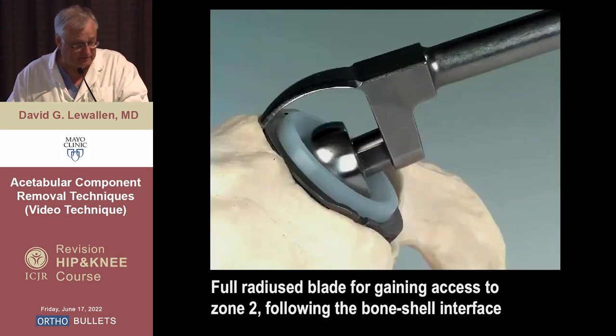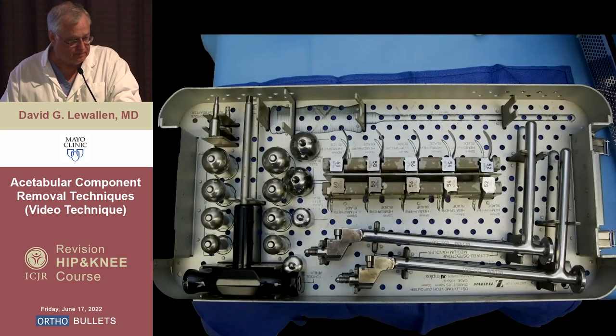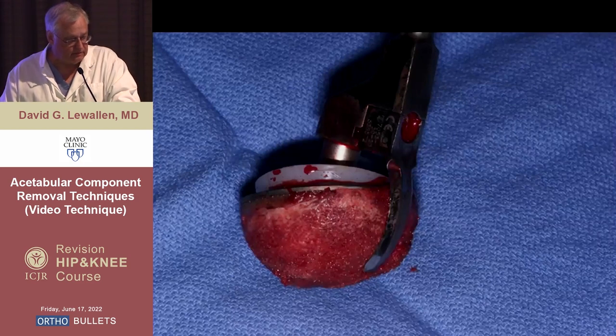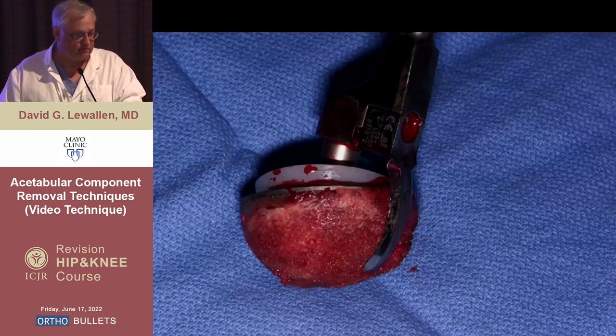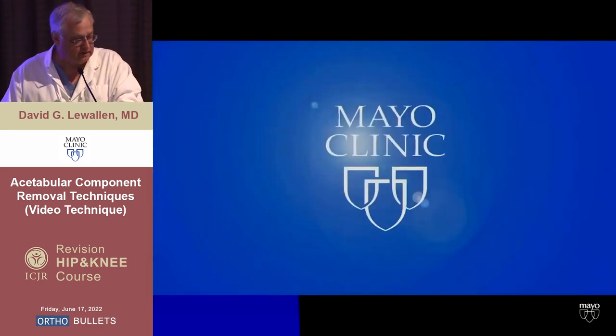This rotatory movement is helpful after you first go around the clock — one o'clock, two o'clock, three o'clock — around the rim. Good exposure is essential to do this, and then you can connect the dots in a rotatory fashion. This shows the big blade going in and what the set looks like. You lose a little bit of bone sometimes, but not very much, and you don't have the catastrophic bone loss that was all too common in the old days with hand instruments and curved osteotomes.